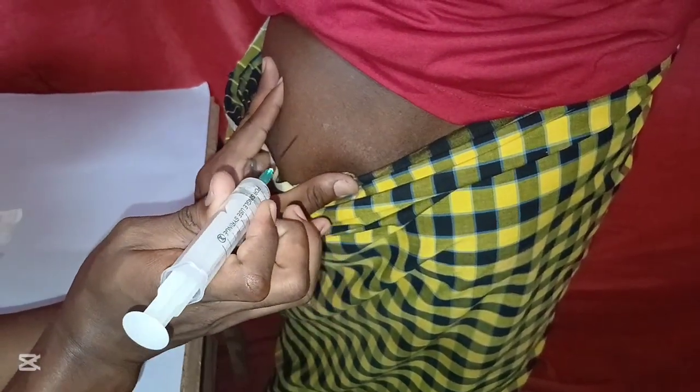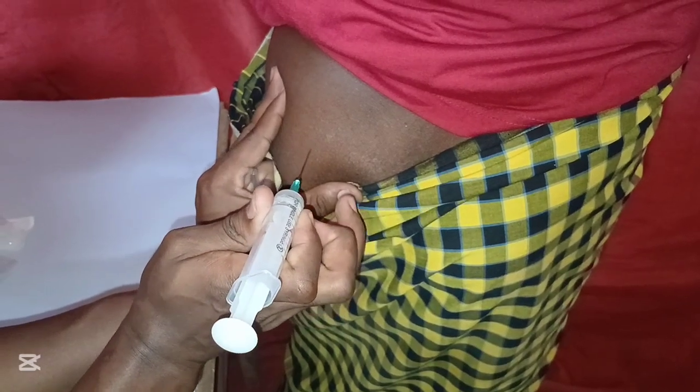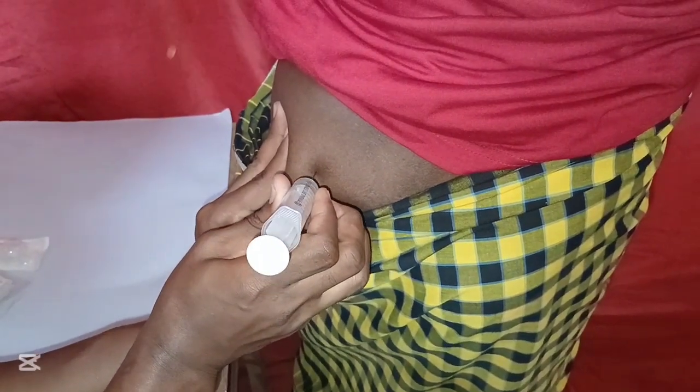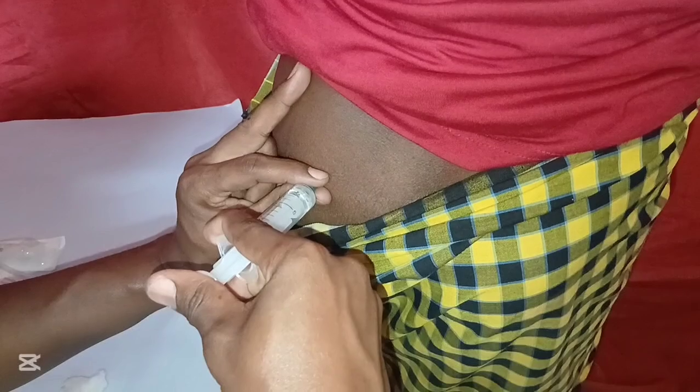Then get the drug, remove the cap of the needle. Grab the skin first, insert at a 90-degree angle deep into the muscle, then release the skin. Grab the cap of the needle, spread, and pull back the plunger. If there's no flashback — that is a drop of blood — you administer the drug safely to the patient.